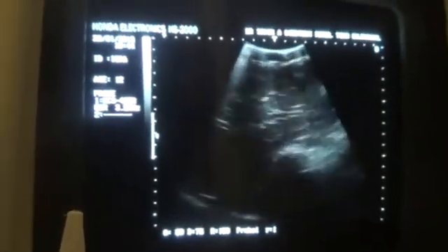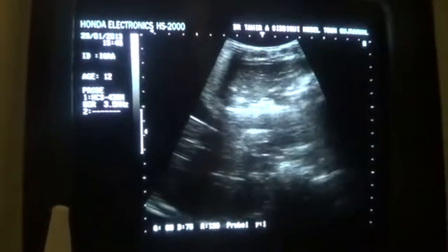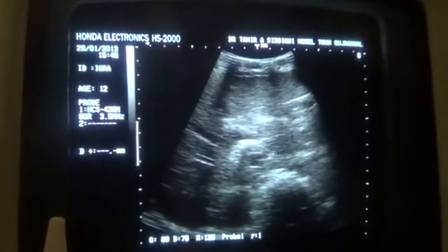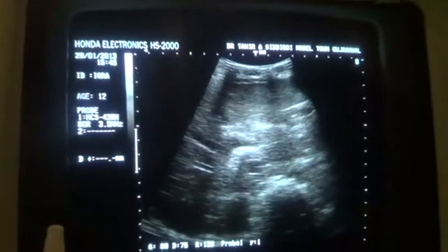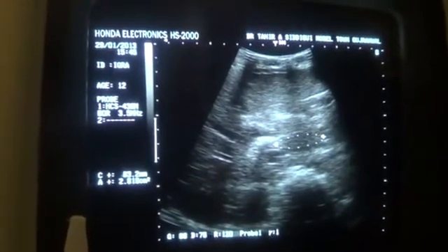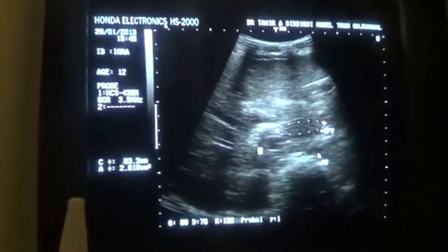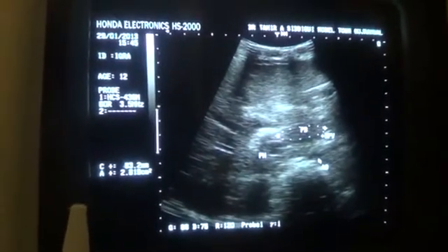Now when I say that this is the pancreas in transverse section, what makes you believe, or me believe, that this is a pancreas? Because this is the splenic vein, which is the landmark for the identification of the pancreas, and this is the superior mesenteric vein making the portosplenic confluence. These gases are from the duodenum, and here we see the transverse section of the pancreas. This is the aorta, this is the spine, this is the pancreatic head, and this is the pancreatic body.